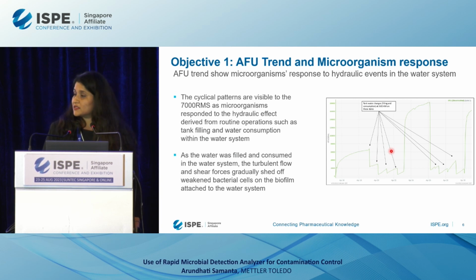This is what we call the signature of the water system. Once you have the analyzer online, you will know the signature of your water system. And that's exactly what you're looking for to understand the regular operation and how your AFU values will differ.